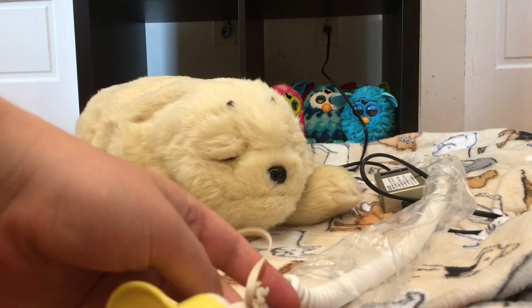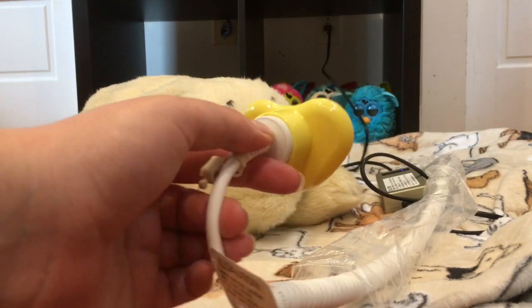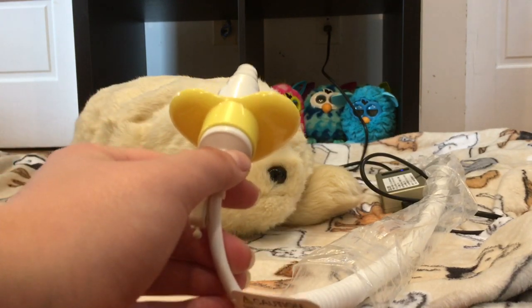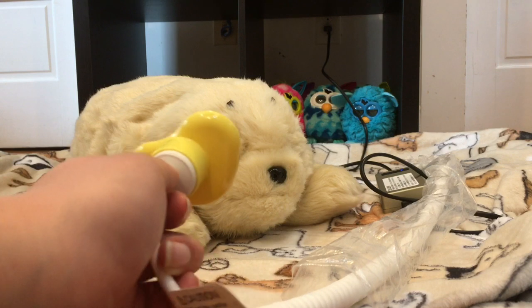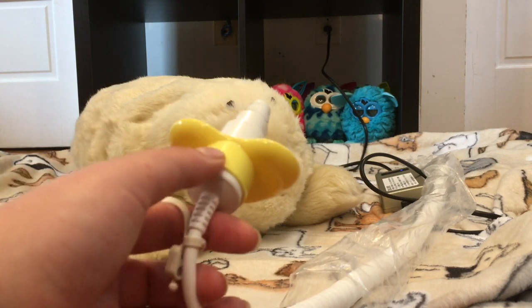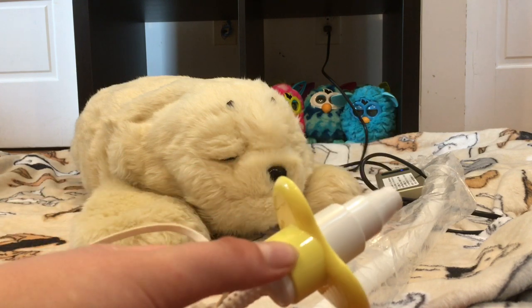The end of the charger here, the plug, is designed to look like a little pacifier with a little heart design on it. When you buy a PARO brand new, you'll receive both a little yellow heart accessory and a clear pink heart accessory. I only have the yellow one, but a brand new PARO will come with both.